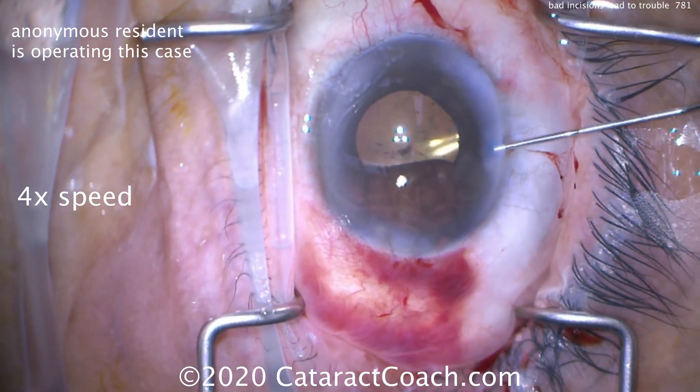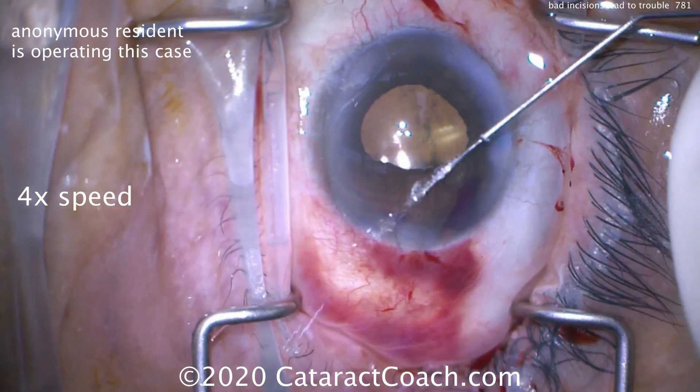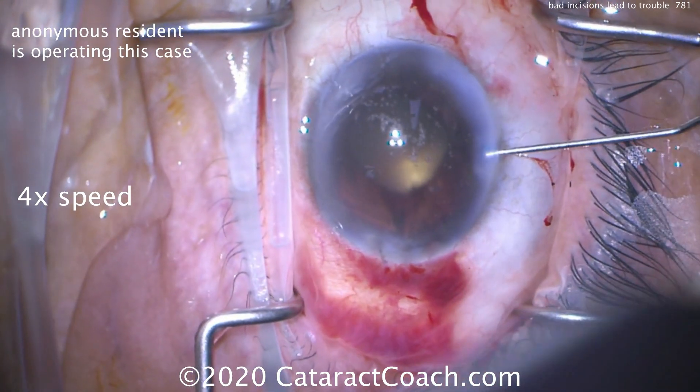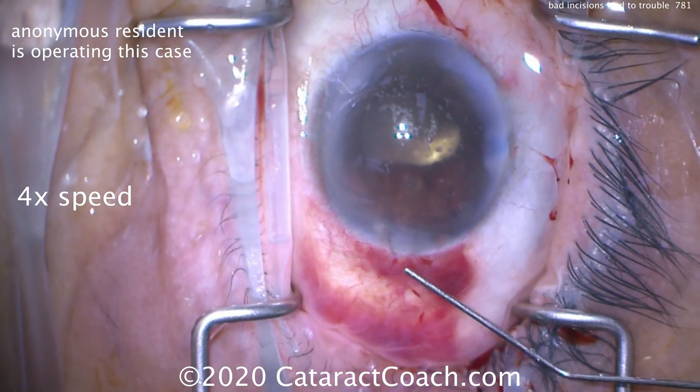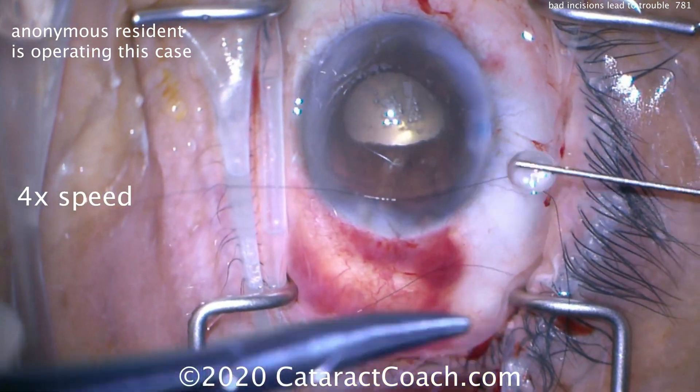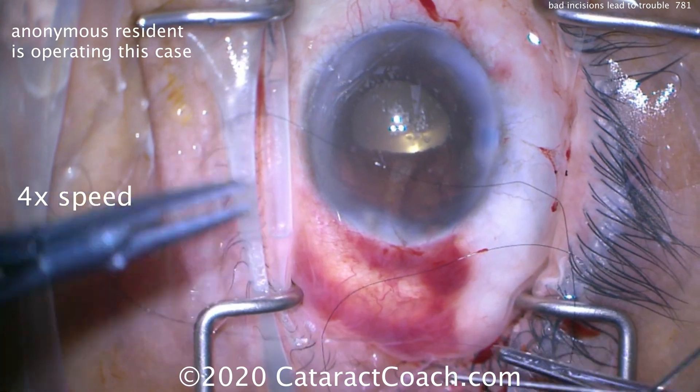Don't hesitate — if you need to, put another suture in. Not a big deal. You don't want the incisions to leak at all, and you certainly don't want iris prolapse. There's a little bit of a bleed that went into the anterior chamber of the eye, so that one suture is going to be replaced.